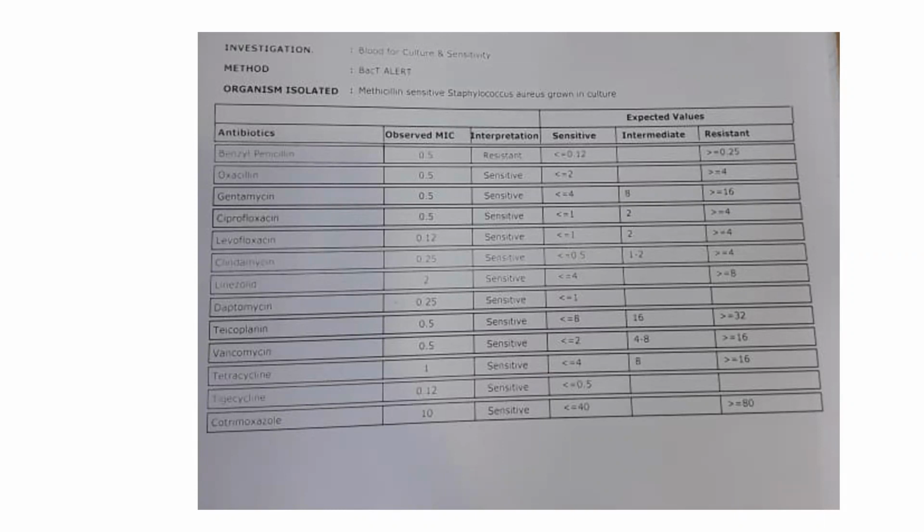Let's say we thought gram negative. So Vitek will identify what it is. But a microbiologist is able to tell you what is the likely bacteria even before you go to the Vitek report. So they can tell you the identification of the organism on most of the occasions. Sometimes there are similar looking bacteria, so they may go wrong, but many times you can identify at least the bacteria based on the colony morphology on the agar plates. So that's about the ID. Sensitivity, obviously they cannot predict just looking at the plates.